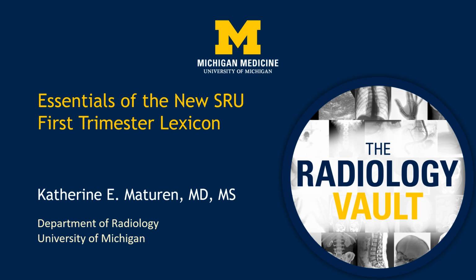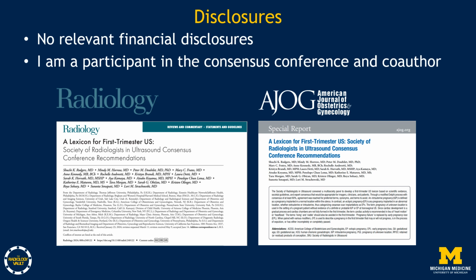Hi, this is Kate Maturen. I'm happy to be with you today to speak with you about the essentials of the new Society of Radiologists in Ultrasound First Trimester Pregnancy Lexicon. I have no relevant financial disclosures, but I was a participant in the Consensus Conference and a co-author of these two papers, which are the source of most of the material in this talk and are referenced throughout.